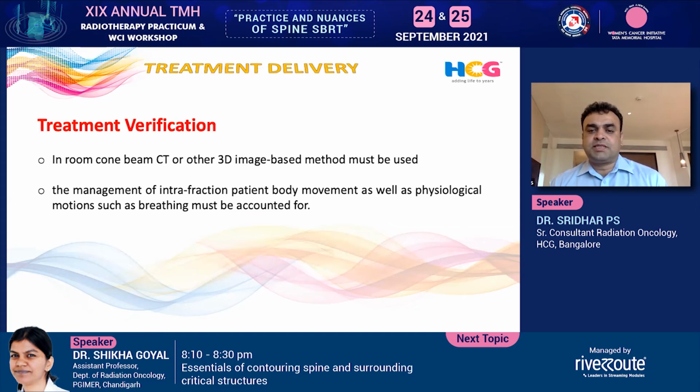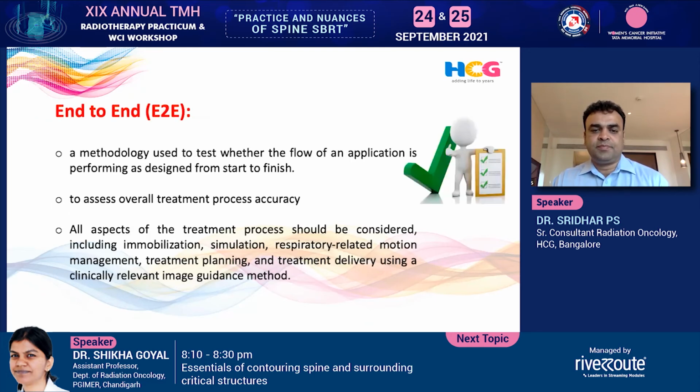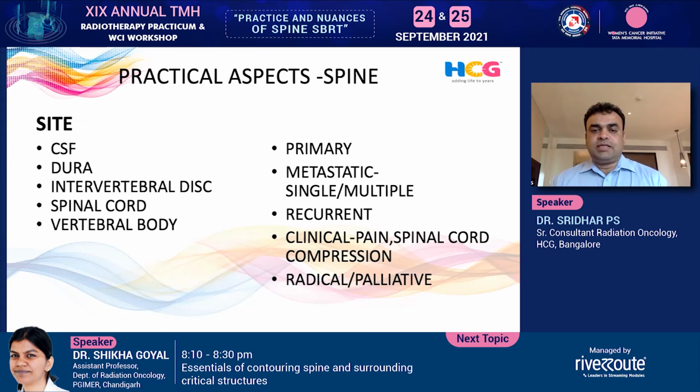With higher image guidance, your immobilization should be minimal and should not cause discomfort. Nowadays people say to keep it as minimal as possible and make the patient's comfort the key, because of your higher image guidance and the short duration of treatment. So the quality assurance should be taken care of at each step in these patients.